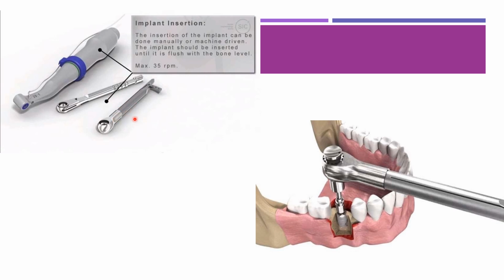Insertion of the implant must follow the same path or line as the osteotomy site. You can see that the outer non-sterile covering should be opened by the assistant without touching the inner sterile vial, which contains the implant and the implant screw. It will be carried to the site by the hand ratchet. So here it is, the hand ratchet. It will be attached to the hex drive, and this will be taken with the implant and carried to the site by the ratchet.